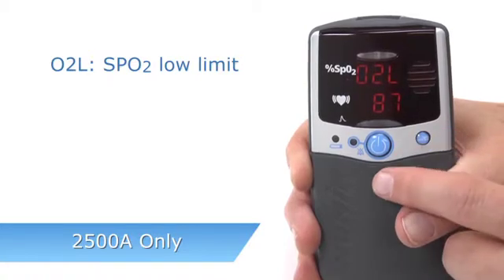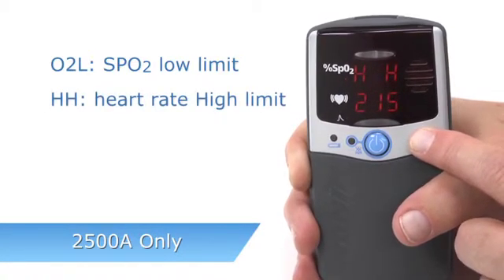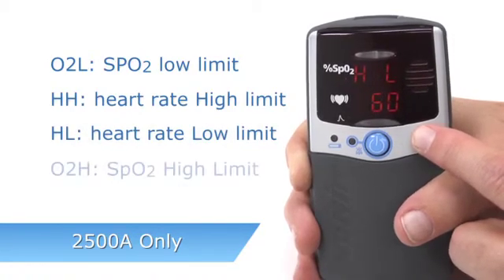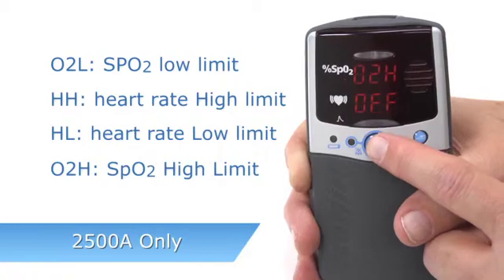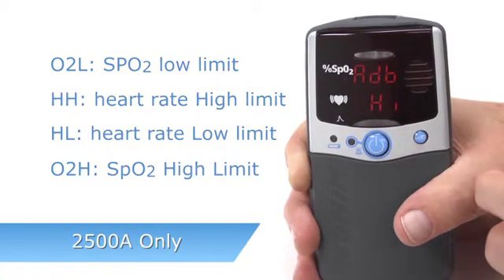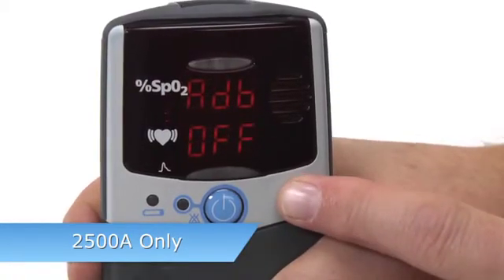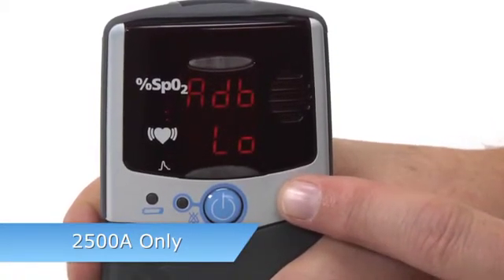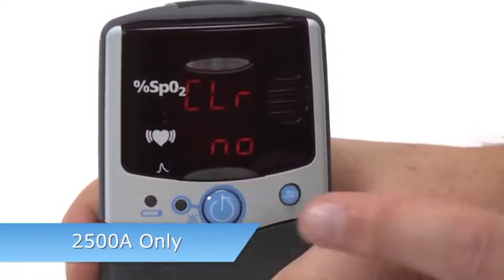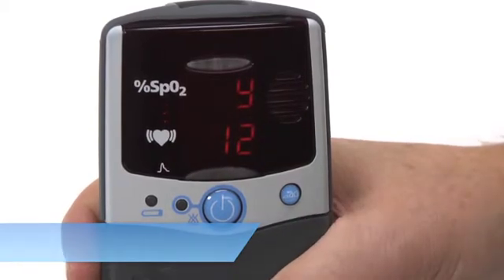If you clear custom alarm settings, you can scroll through and reset all values on the oximeter. O2L is the SpO2 low limit. HH is heart rate high. HL is heart rate low. And O2H is SpO2 high, appearing in that order. You can see the audible alarm setting, which may be high, low, or off. You will then enter the memory, date, and clock settings just like the 2500 model.